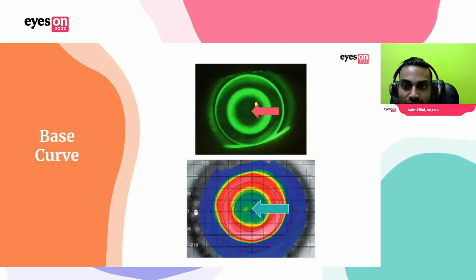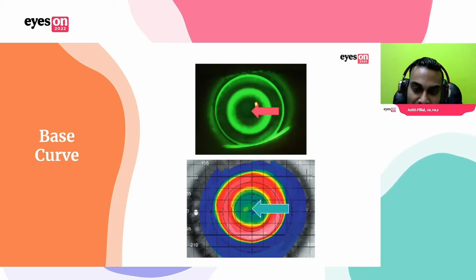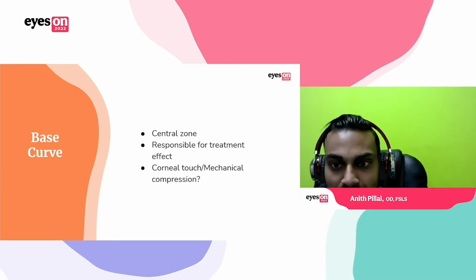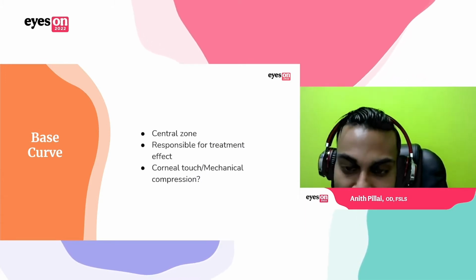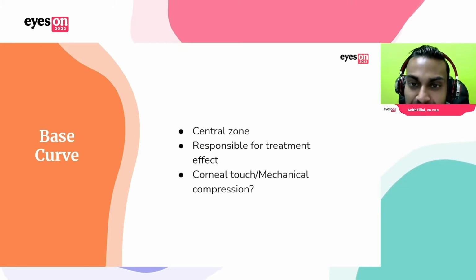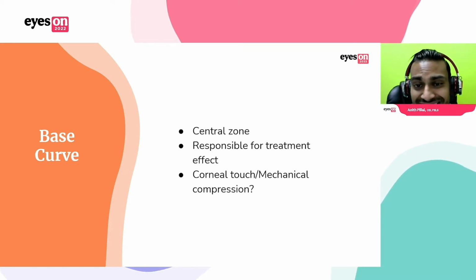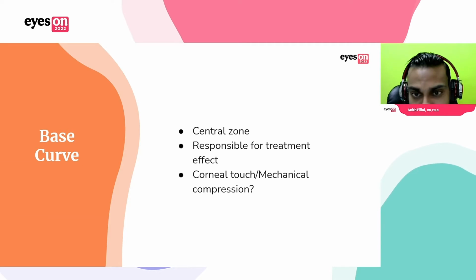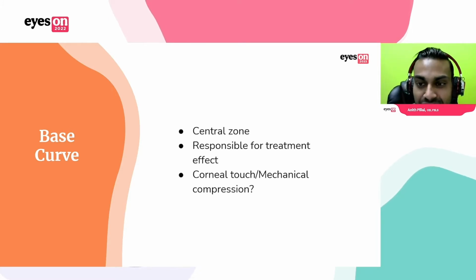The base curve, right in the center, is that area of what looks like central bearing, seen there with the red arrow on a fluorescein image, and then the topographical depiction on the bottom. The base curve here is unlike any other RGP design. If you're a specialty contact lens fitter or have done a lot of RGPs, you're used to manipulating the base curve to alter the fit. Well, in Ortho-K, that's not what we're doing. The base curve has absolutely nothing to do with the fit. If there's a fit issue, do not manipulate the base curve. That is not the area you want to mess with. This is purely for treatment effect.